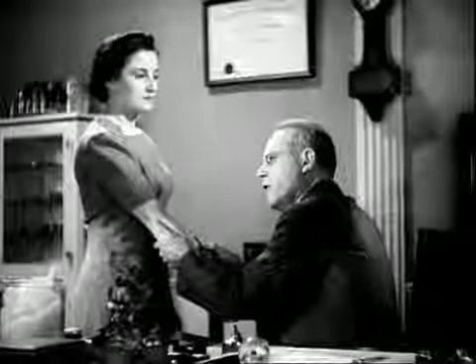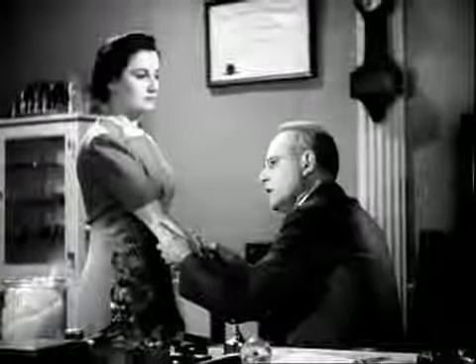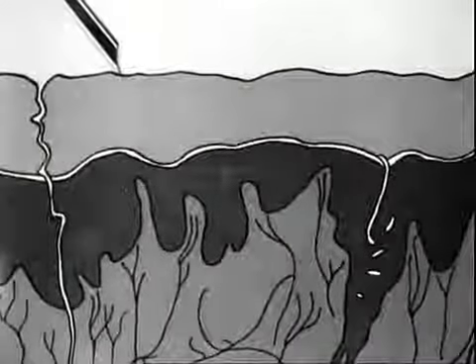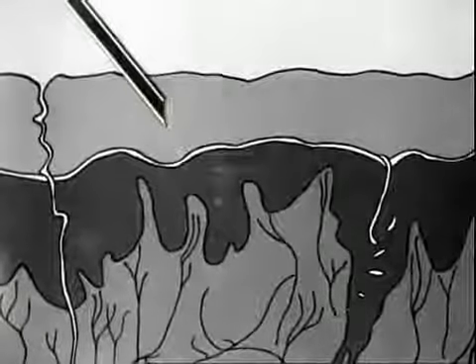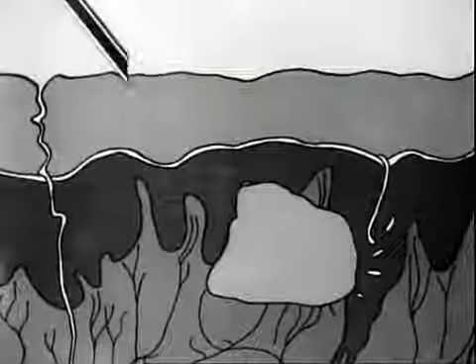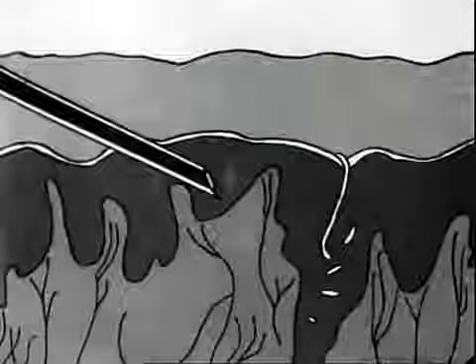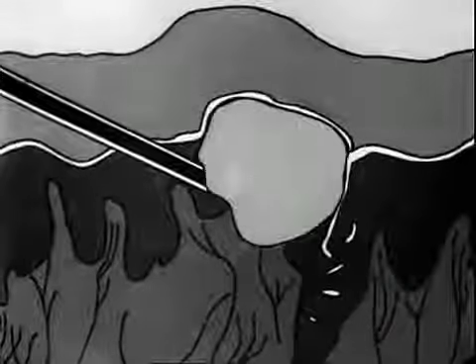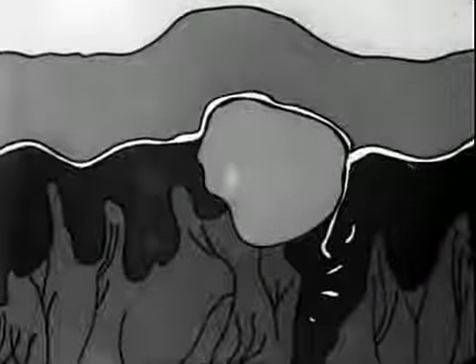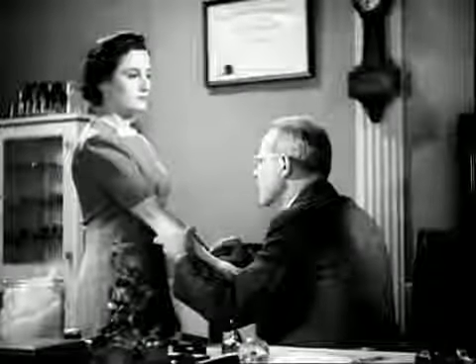Insert the needle intradermally. This is important, for if the solution is injected under the skin, no skin reaction may result. Here's a diagram to make this point clear. This is the wrong way. If done like this, the right way, a small white wheal will rise over the needle point. Hold the needle almost parallel to the skin as it is inserted. Inject 1/10 of a cubic centimeter of the tuberculin solution.